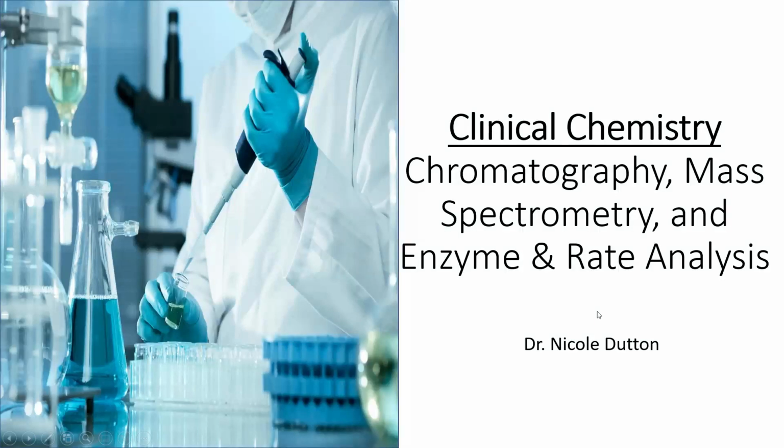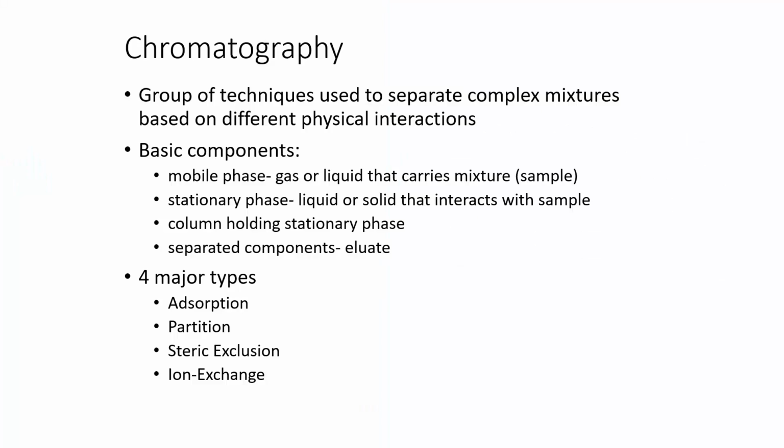Clinical chemistry, chromatography, mass spectrometry, and enzyme and rate analysis. Chromatography is a group of techniques used to separate complex mixtures based on different physical interactions.